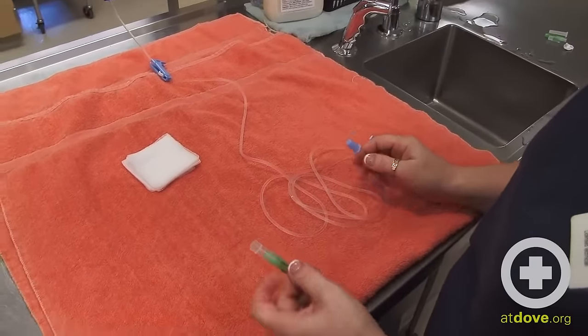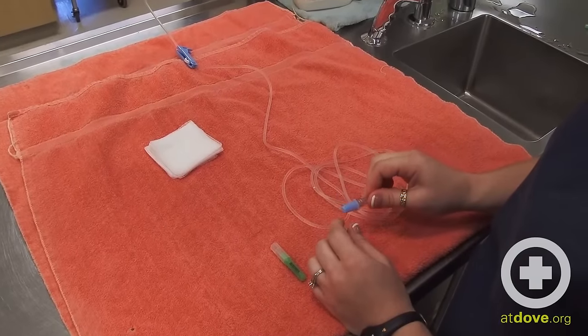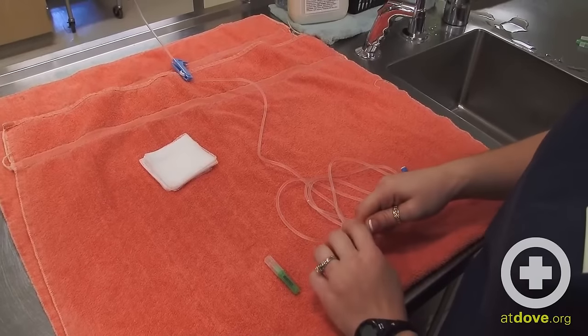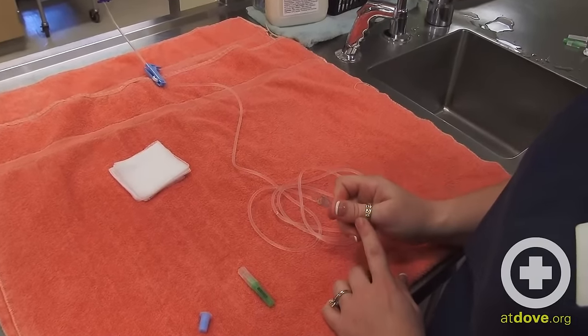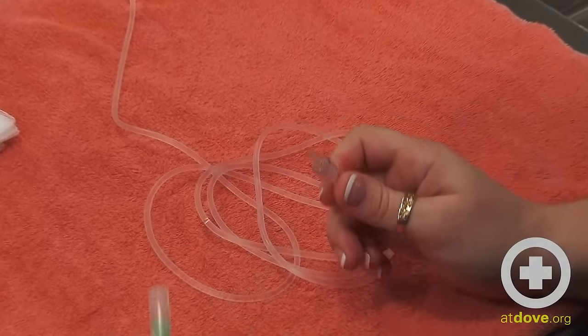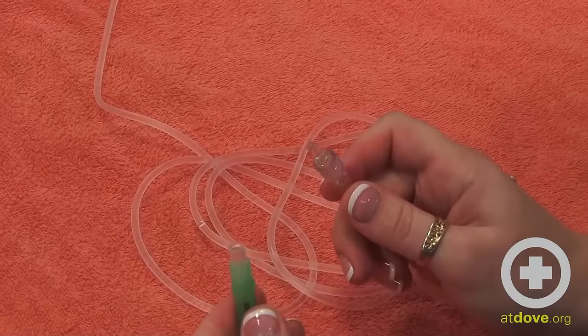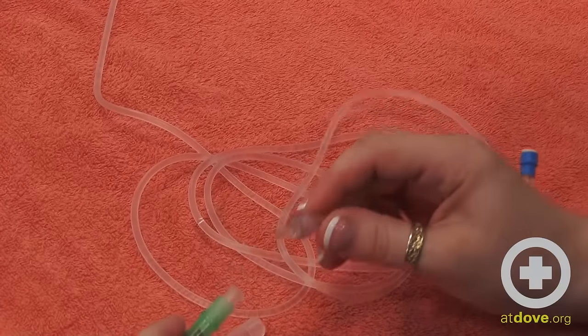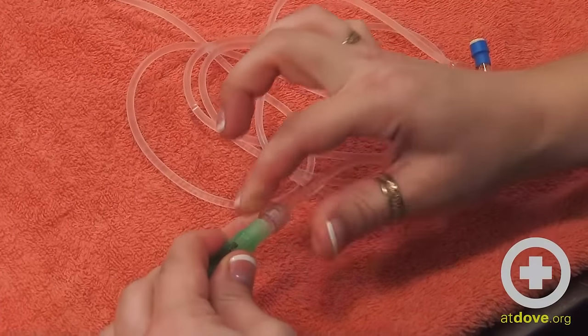Now I'm going to put my needle on. To do that there is a little cap at the end of the drip set — give a nice twist and get that open. This part is again sterile; you don't want to touch it. I'll do the same with my needle, giving me another sterile area. These two fit together and then there is a twist to lock it into place.